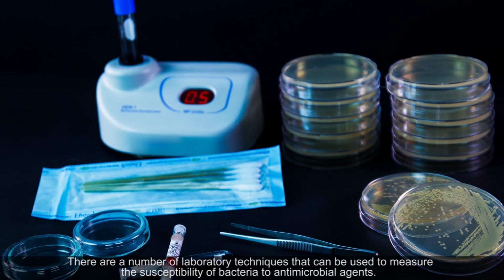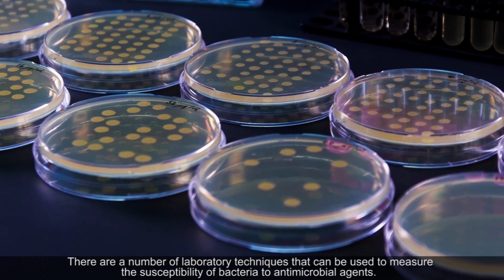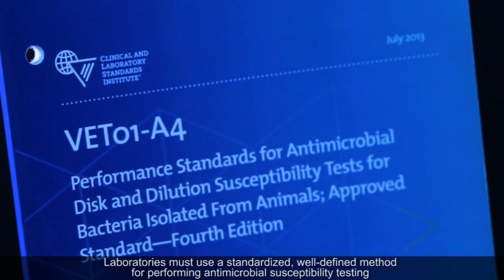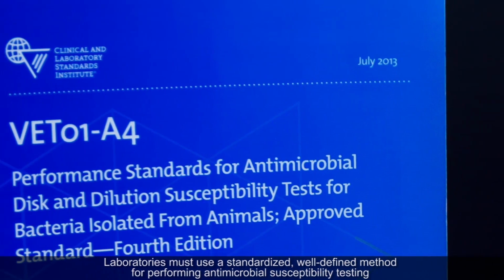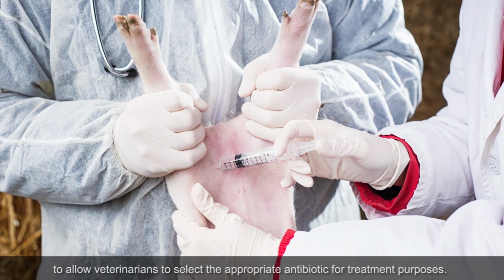There are a number of laboratory techniques that can be used to measure the susceptibility of bacteria to antimicrobial agents. Laboratories must use a standardized, well-defined method for performing antimicrobial susceptibility testing to allow veterinarians to select the appropriate antibiotic for treatment purposes.